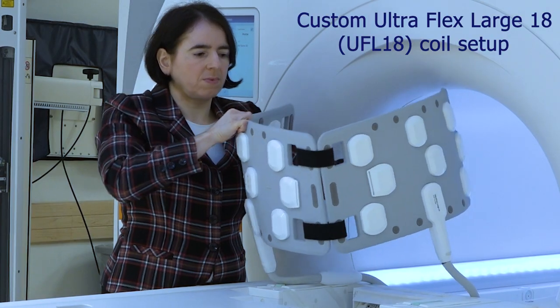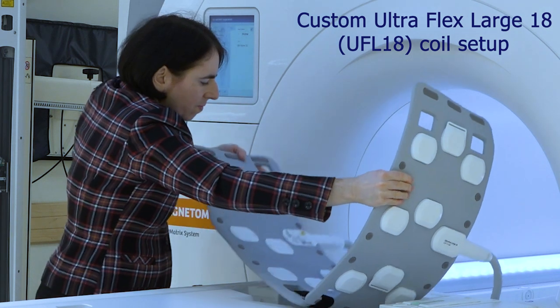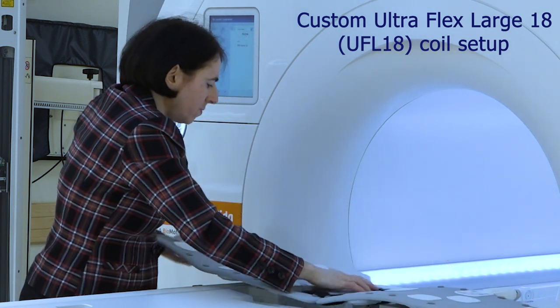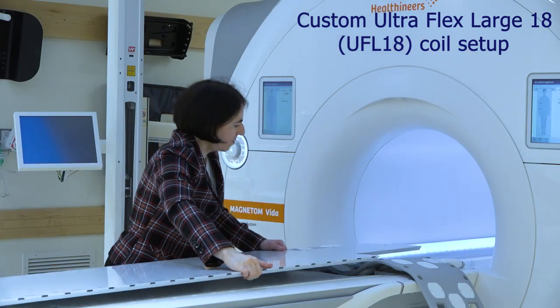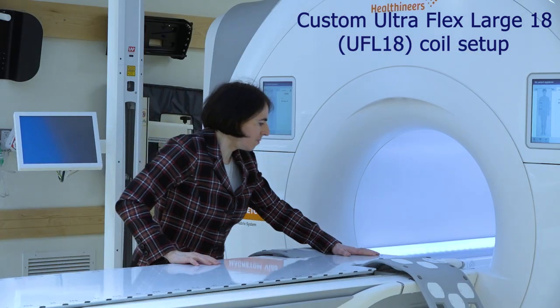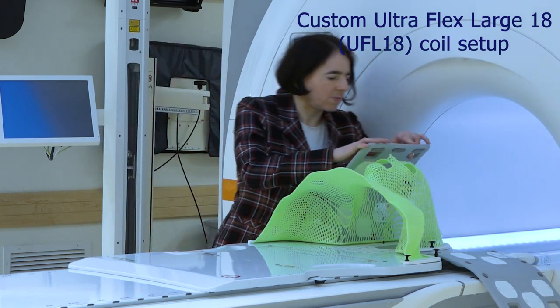We propose a custom solution by attaching two UltraFlexLarge 18 coils and placing them in the head recess of the scanner couch. We use a slightly modified tabletop, place the board with a mask on top, and close the coils over the mask.